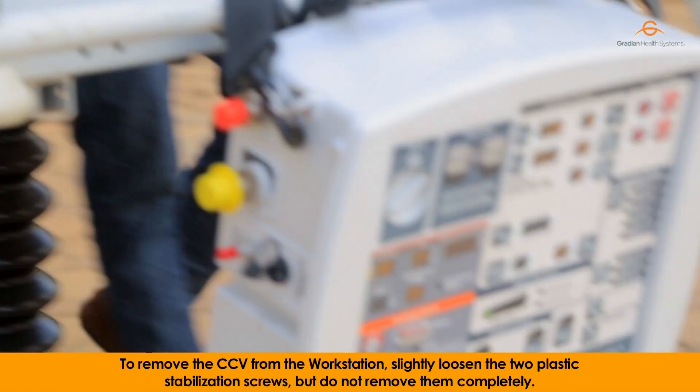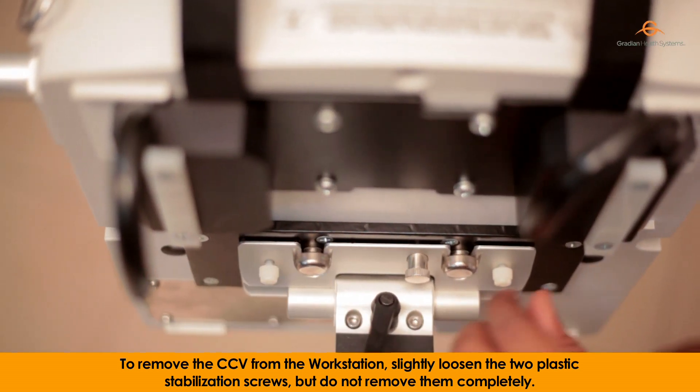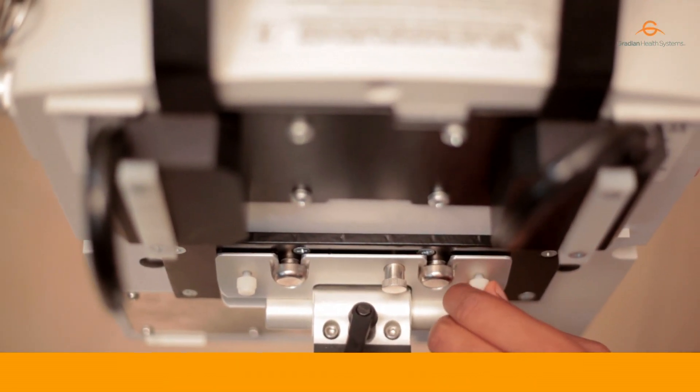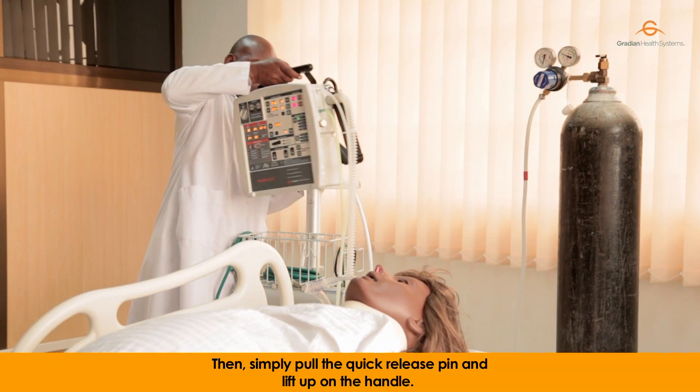To remove the CCV from the workstation, slightly loosen the two plastic stabilization screws, but do not remove them completely. Then, simply pull the quick-release pin and lift up on the handle.